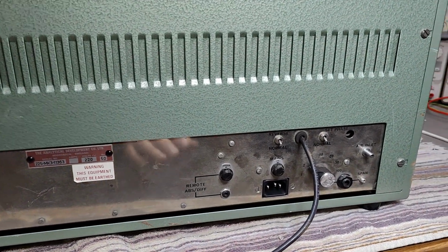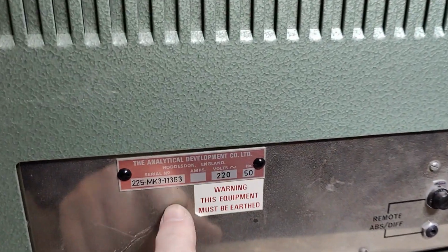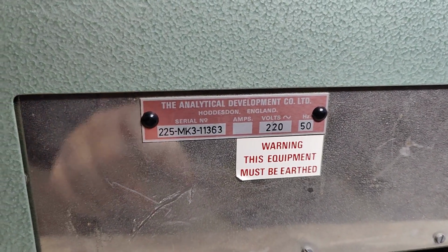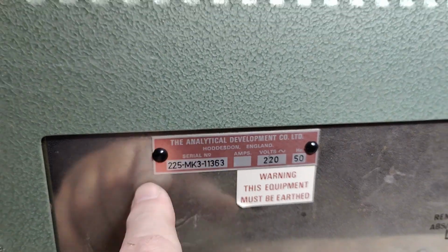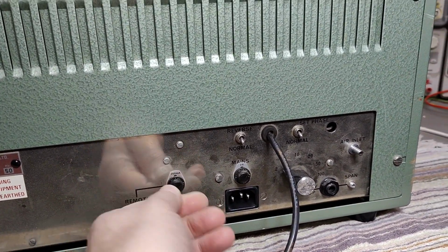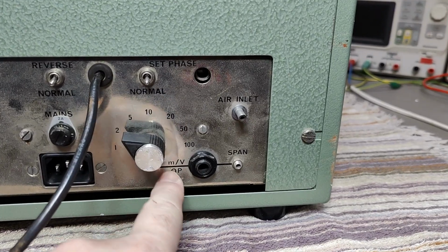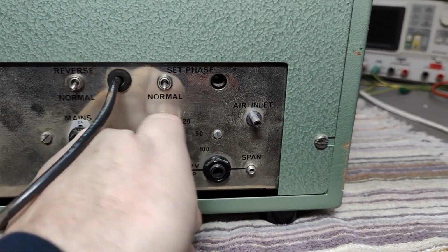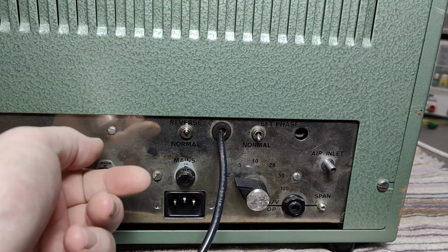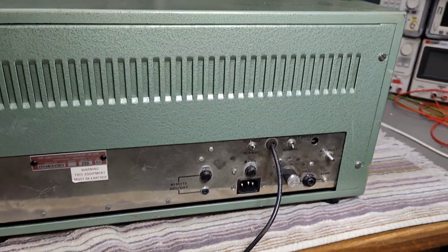It's so heavy. And there's a cable sticking out of the back with a BNC connector. And also we can see it is listed for 220 volts. So that means it is very, very old. I still cannot figure out how old it is, but probably we can figure that out from the internals. We got fuses, mains entry, and there's something here with an output. See how many millivolts or how many ppm or something like that, right? Per volt. So we got some outputs, air inlets, set phase. I don't know if you can reverse this or, yeah, whatever. But I think this is how you open this thing and probably pull something out from the back, right?